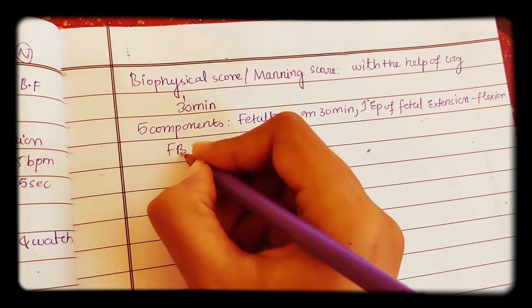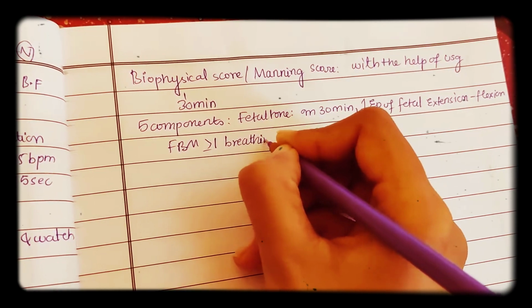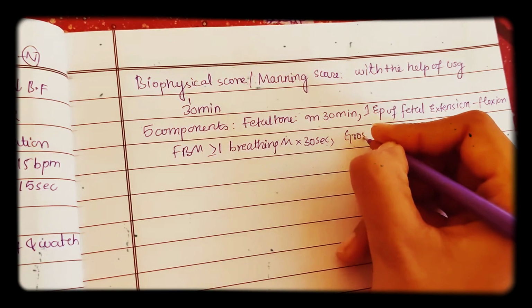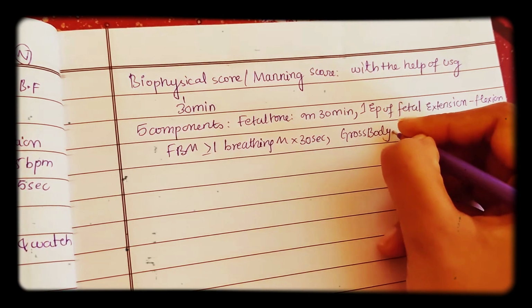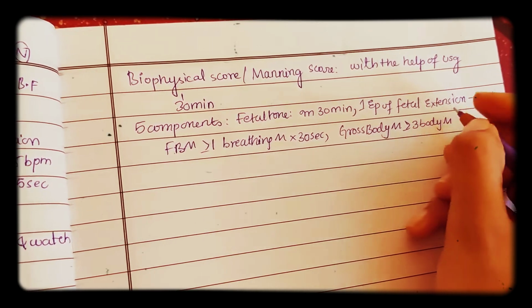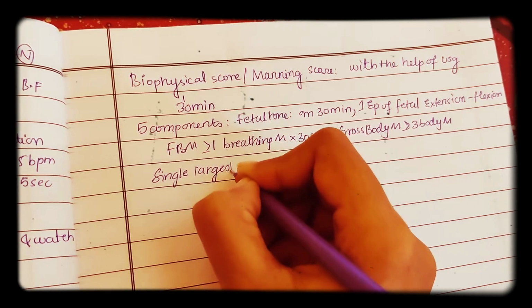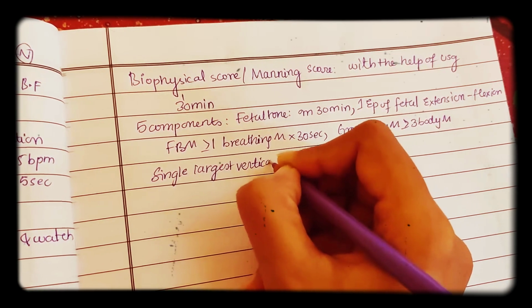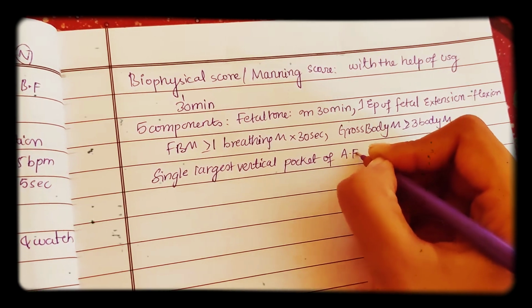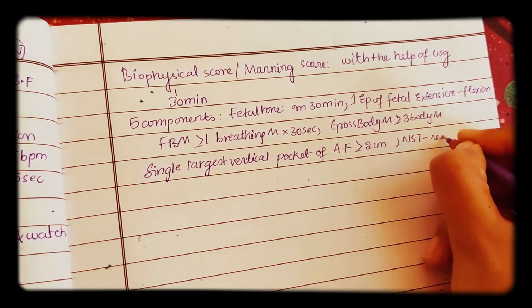Fetal breathing movements will be greater than or equal to 1 breathing movement in 30 seconds, and gross body movements of the fetus is greater than or equal to 3 body movements, and single largest vertical pocket of amniotic fluid will be greater than or equal to 2 centimeters, and NST is reactive.